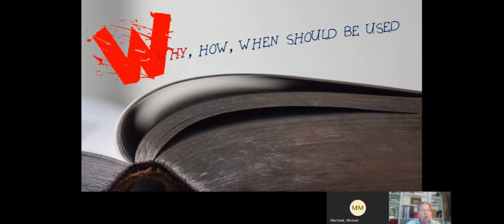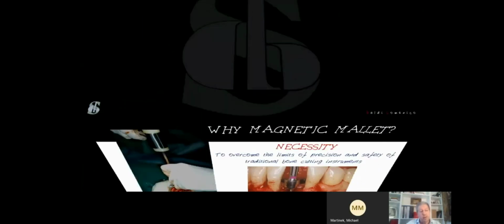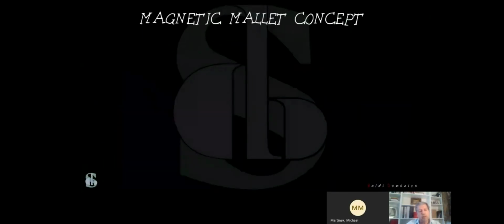So about why, we have to understand and also analyze why the magnetic mallet could be useful, because we have a necessity. We have the necessity to overcome the limits of precision and safety of a traditional bone cutting instrument. And when we speak about traditional, we are speaking about the burr and the manual osteotome.